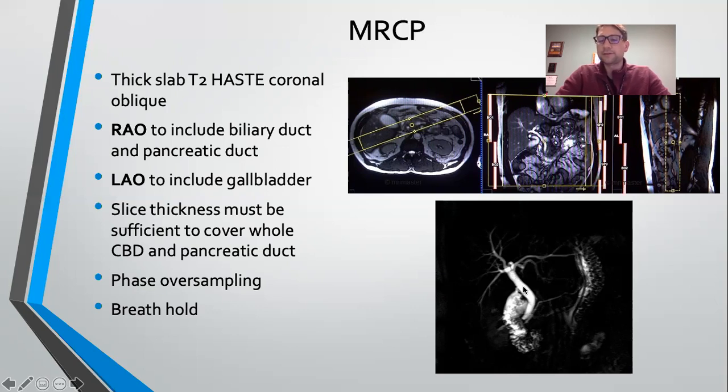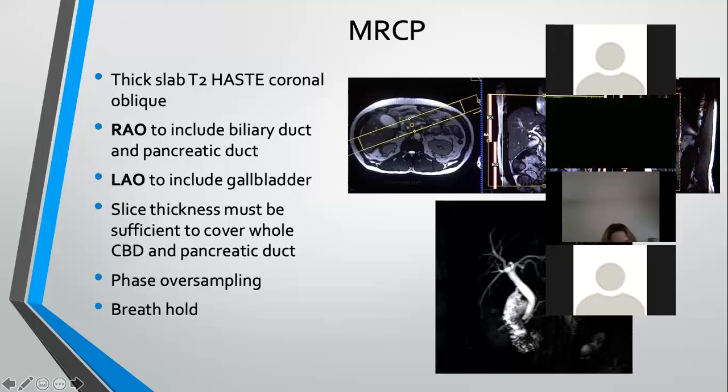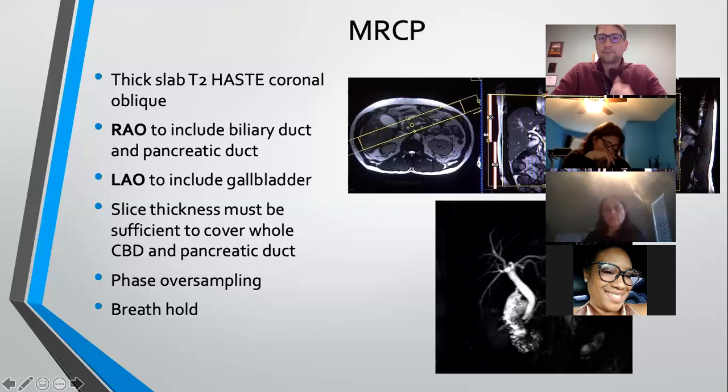biliary ducts. It's called an MRCP because it's like our ERCP. What's an ERCP in X-ray? Endo something.